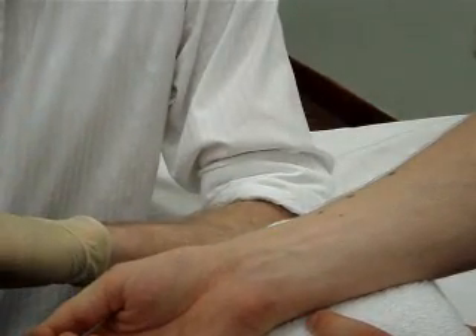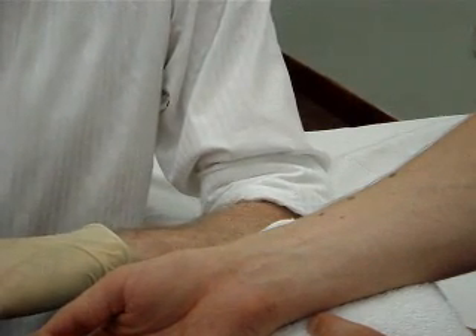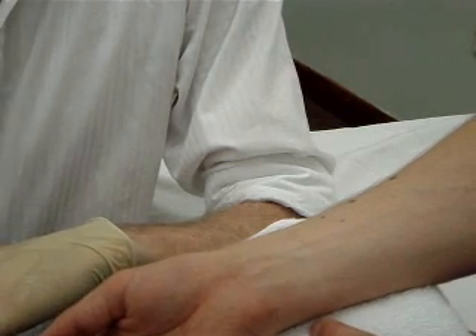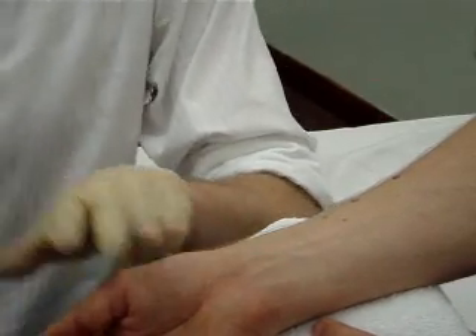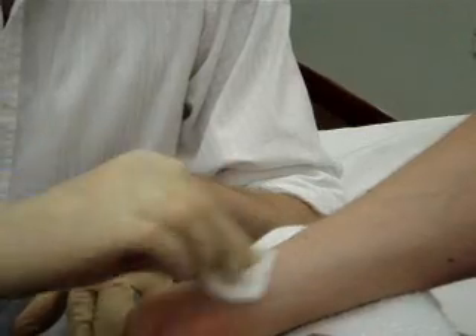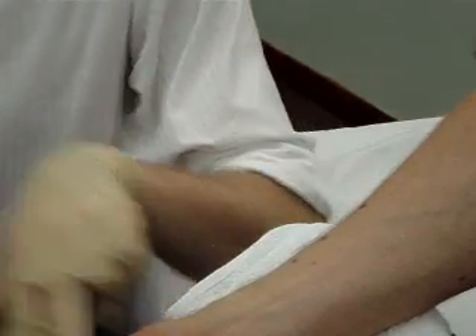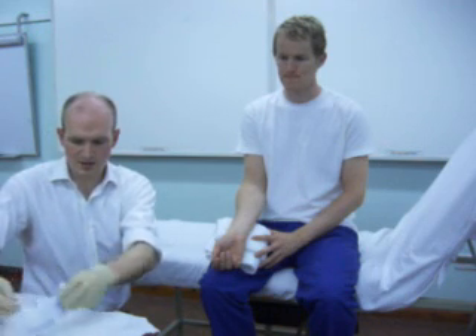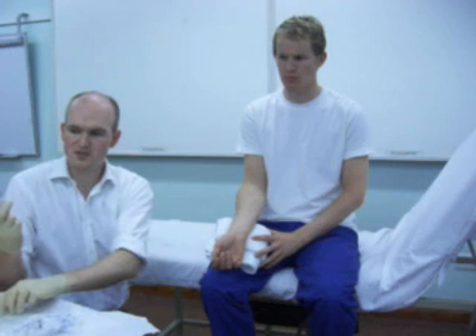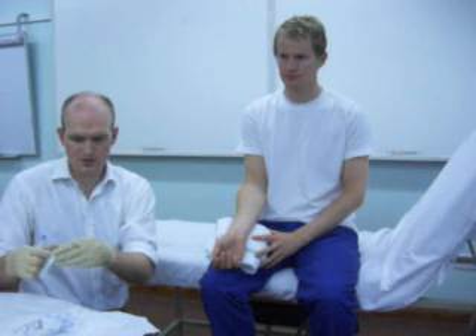There's a small risk of less than one in a thousand of causing damage to the radial artery while doing any procedures such as an arterial blood gas or putting an arterial line in, for example. To do the procedure, we need to firstly clean an area of skin. This is the blood gas syringe itself — they come in lots of different forms. This one's pre-filled with heparin, so I'm going to squirt the heparin out and then attach it to the needle that comes in with the blood gas kit.